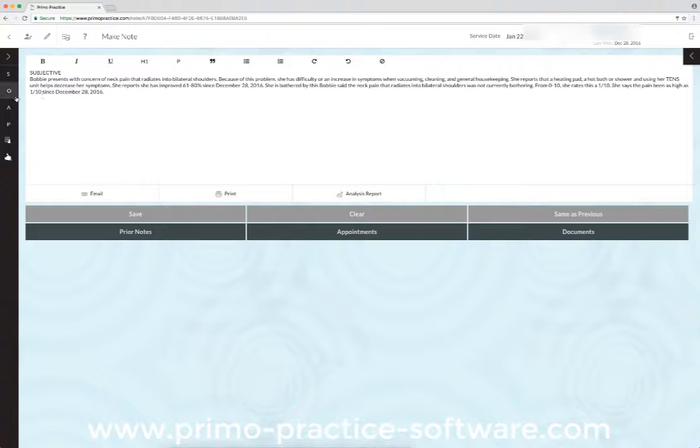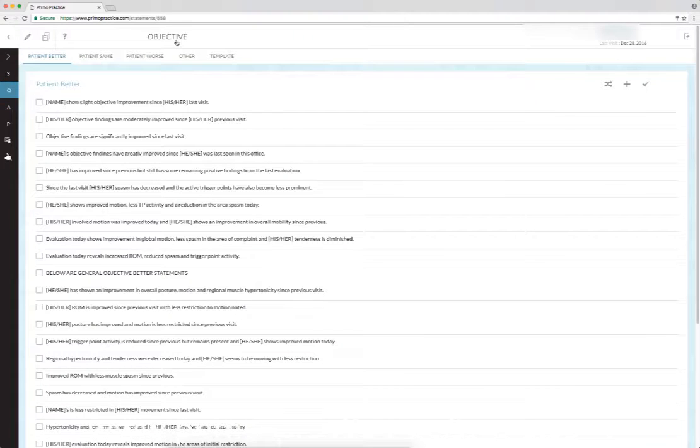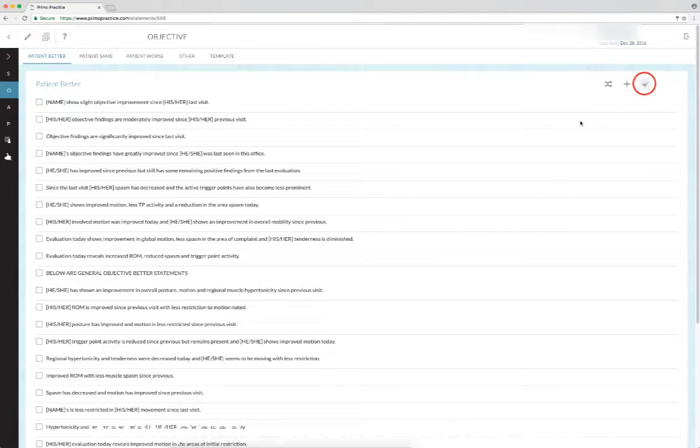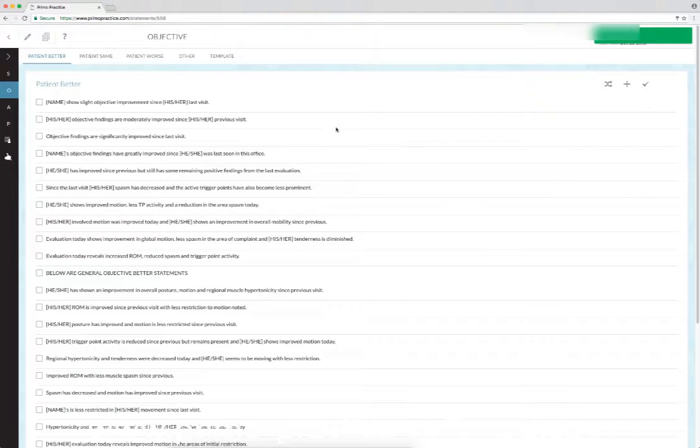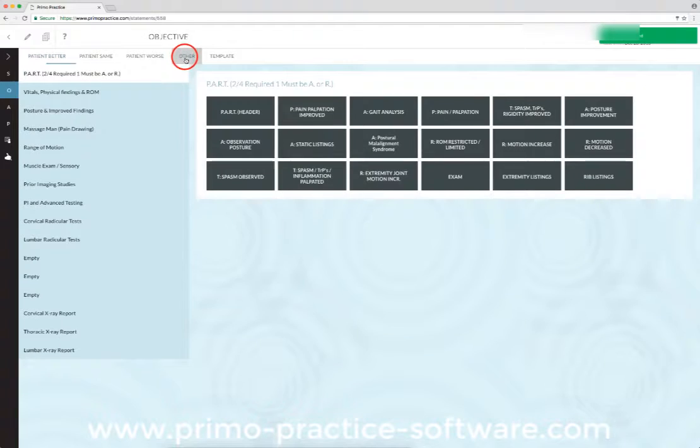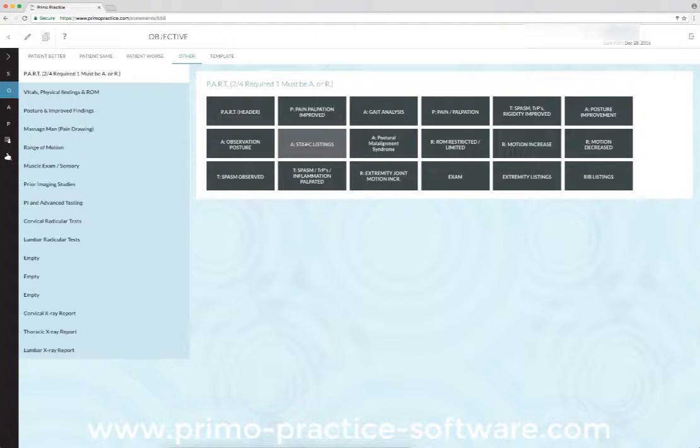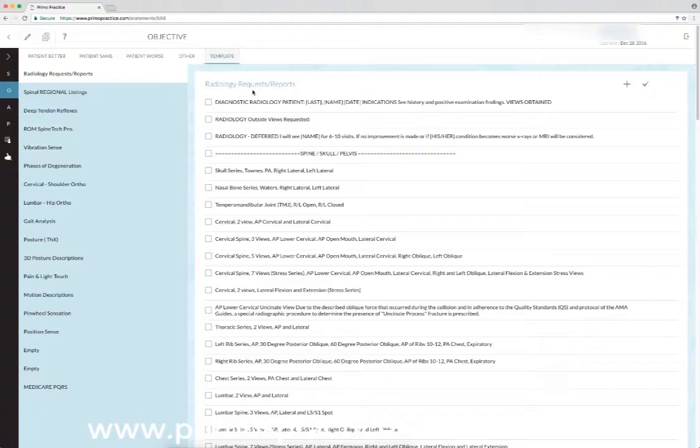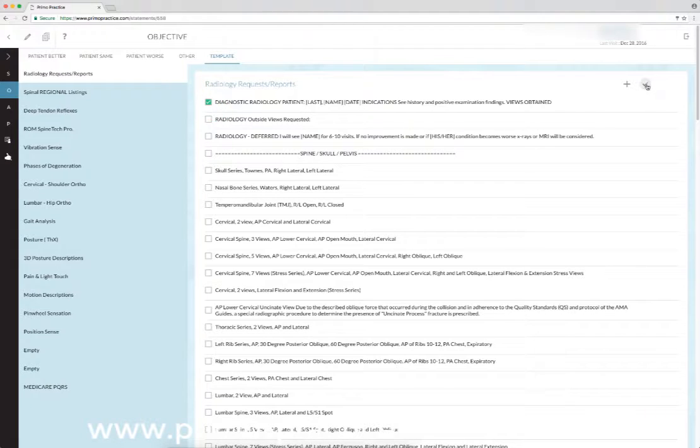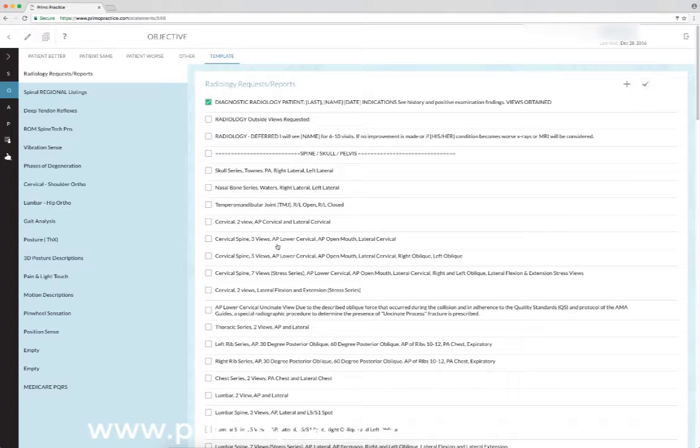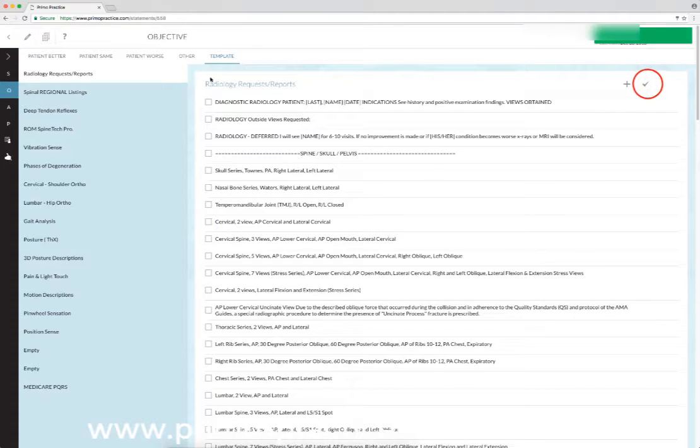Under objective today, I want to say she's doing better, and I want to insert the statement from her x-ray. So I'm going to put in a statement about her x-ray. We'll go to template and put that we did a diagnostic radiology study today for cervical spine, so we'll click that.